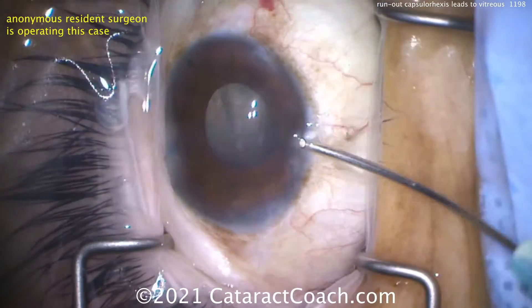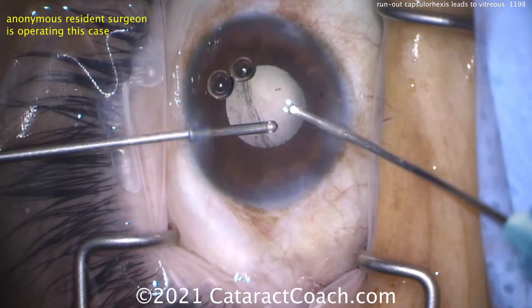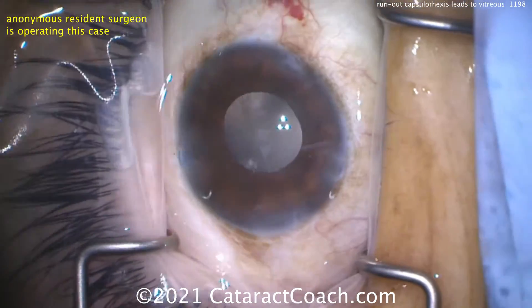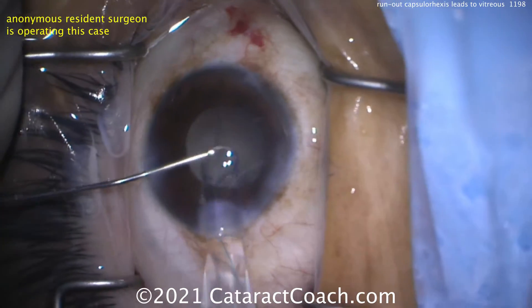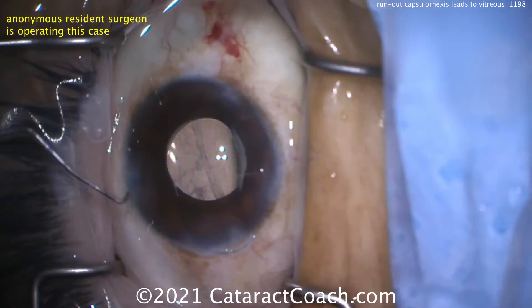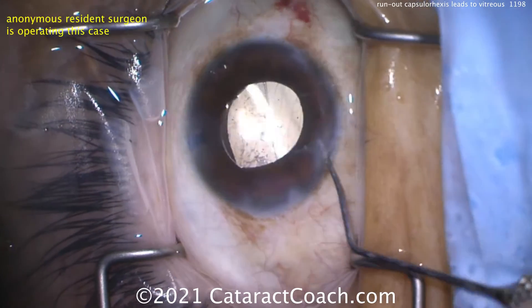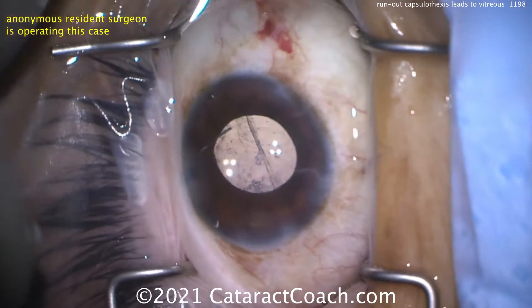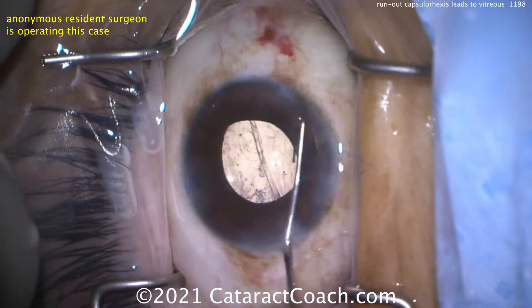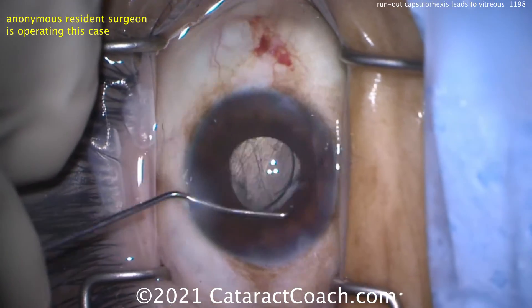Making a quick peripheral iridotomy — not 100% required but sometimes useful in these cases. For an anterior chamber lens you certainly need the peripheral iridotomy; with a sulcus lens you really don't, but if you already have the 23-gauge vitrector it's very easy to do. Now lens insertion: a three-piece lens — put the whole lens on the iris first, check the correct orientation. Dialing it gently into the sulcus one haptic at a time, rotating it in. We want both haptics nicely squared away in the sulcus, positioned in the area of greatest capsular support.